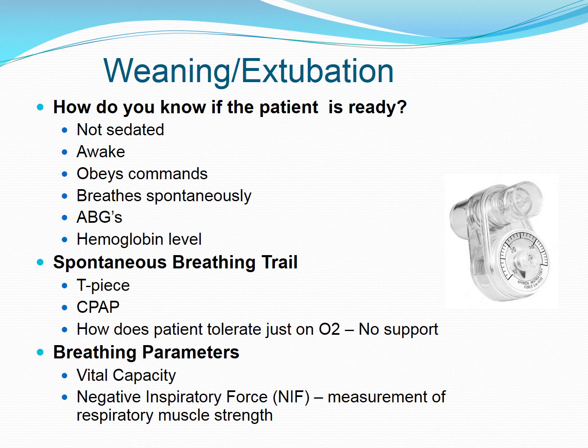So NIF is measuring those respiratory muscles. If that number is greater than 25 centimeters of water, then that patient has adequate muscle strength and we can take them off the ventilator.